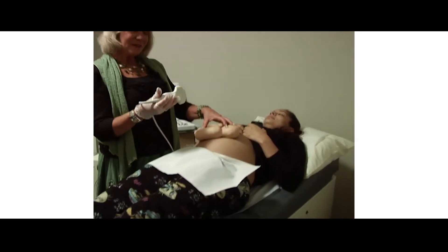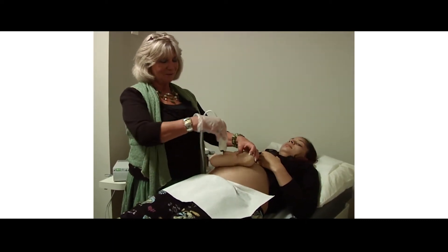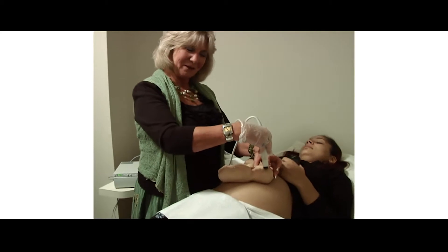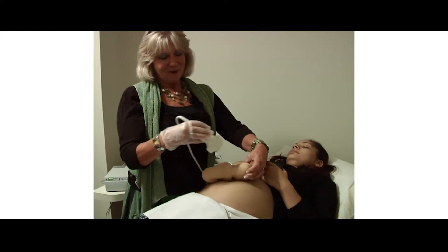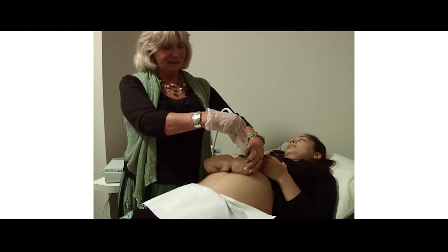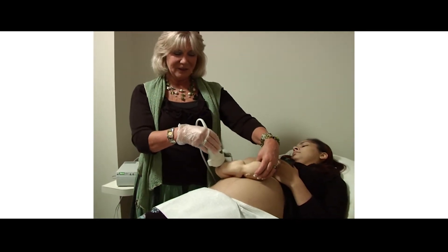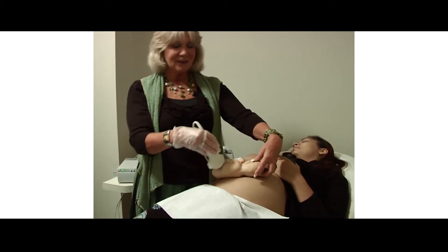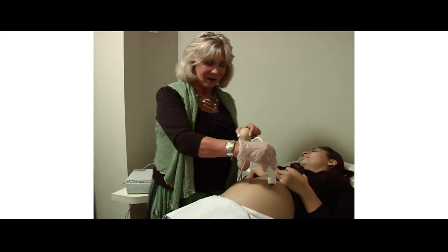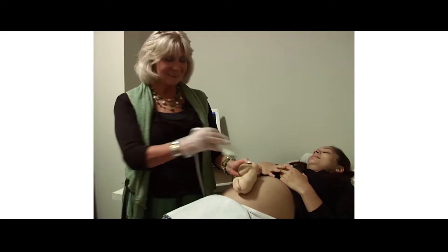You go 90 degrees to fetal lie — that's your road map to your baby. I'm going to tell you to get the head and which way would you drive that transducer? You go up here and try to get your BPD. However, if the baby's looking down or up we're not going to get a good BPD, so forget it. Go back to the baby, go down, get the heart, then go down and try to get a femur. When the baby turns you can go back up and get your BPD. I want you to know where you're scanning — if the baby moves, find the baby's lie again and start all over.